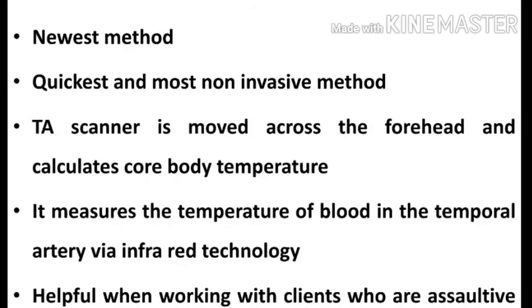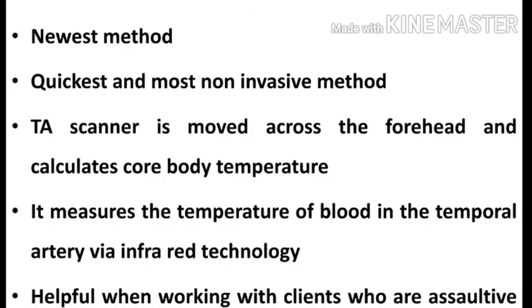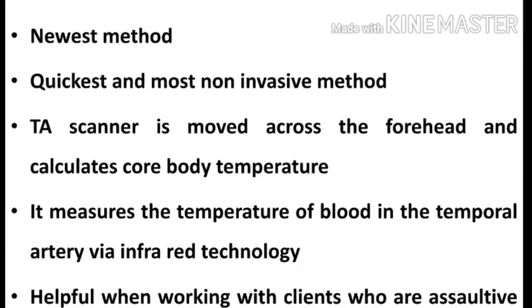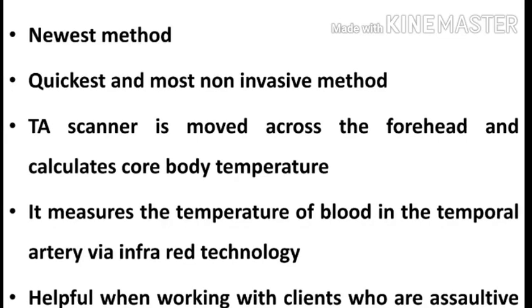So the newer research has suggested that the temporal artery thermometer provides an accurate reading. And nowadays it is commonly used for screening the clients for COVID-19 as there is no need of touching the patient. So these are the different types of thermometers.